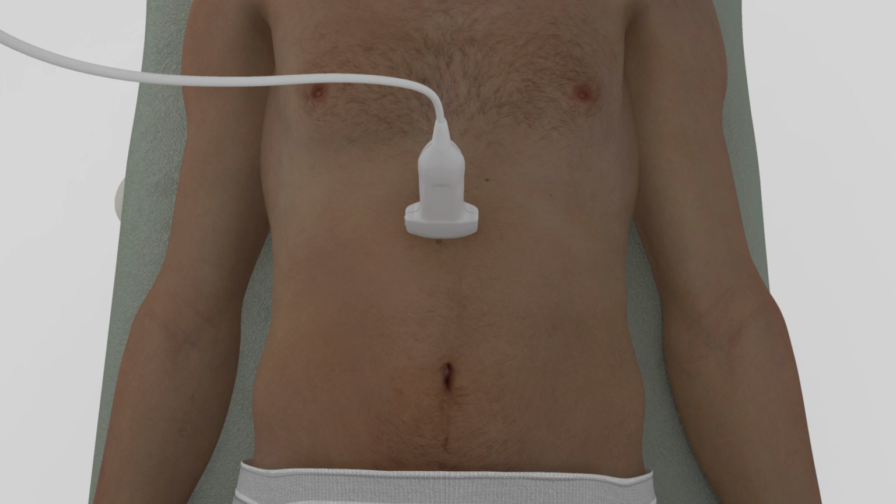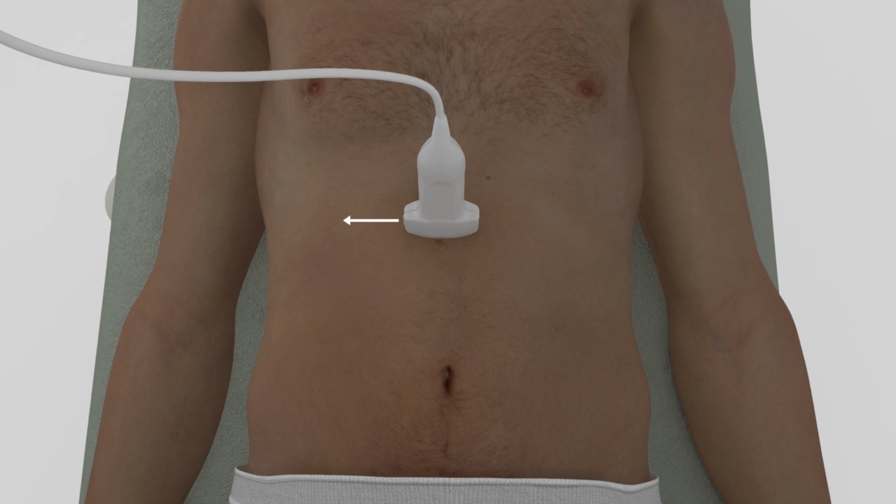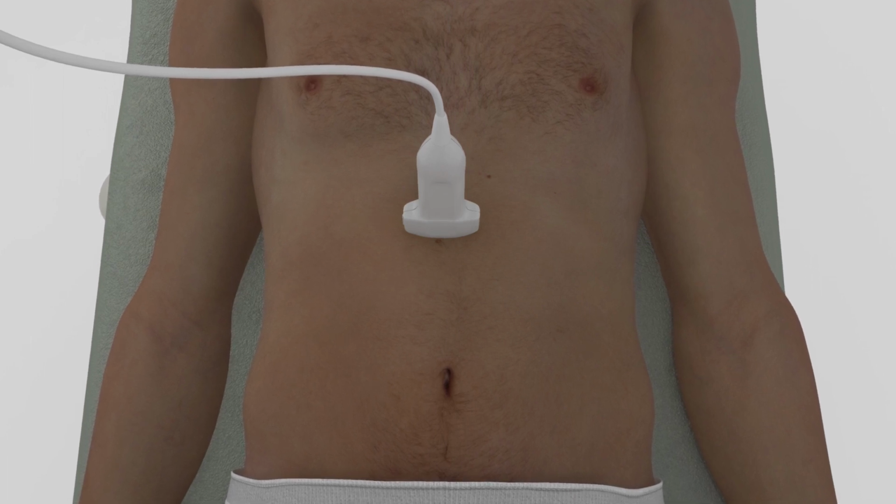First, bring up a view of the abdominal aorta in the transverse plane. Orient the probe so that the probe marker is pointing toward the patient's right. Begin scanning just below the xiphoid process and continue scanning inferiorly to approximately the level of the umbilicus.